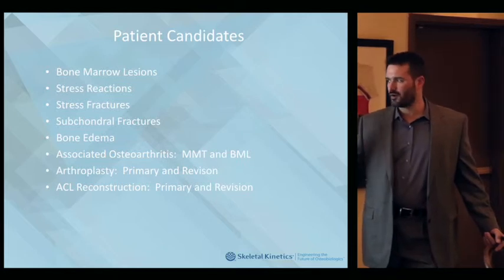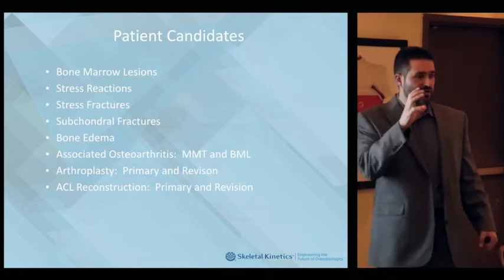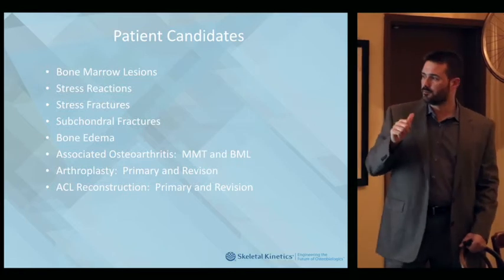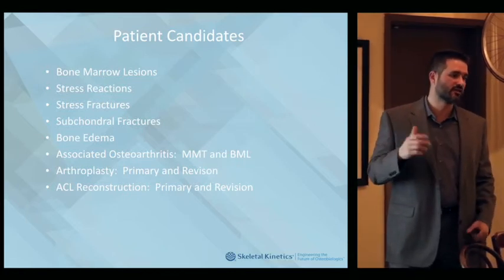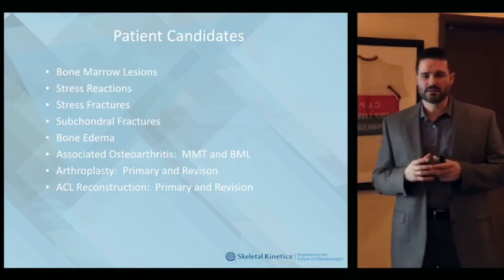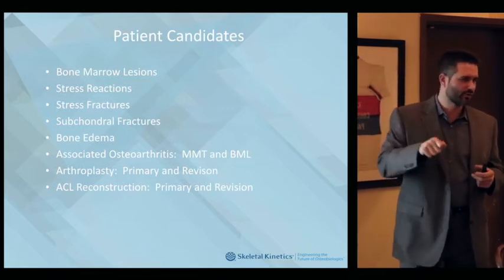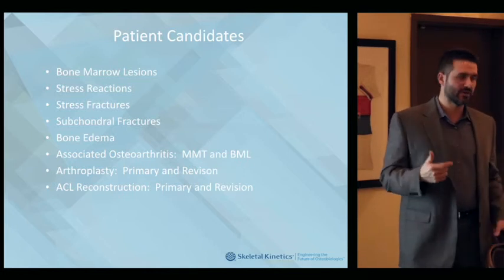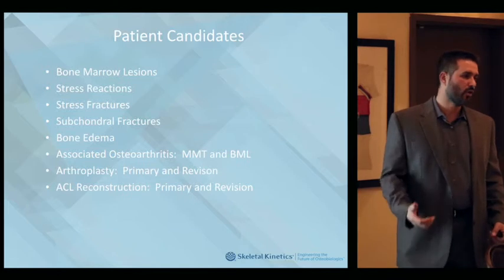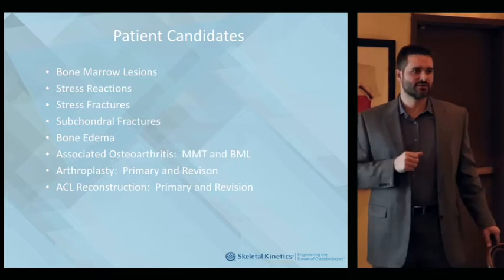I have an associate who was doing a shoulder replacement. It was a revision. Went in, the patient had a big glenoid void, and he needed to fill an area of it. He put that in, let it harden. Came back 3 months later, and couldn't even tell where that void was. So I've thought about some of my glenoids in older patients that might have a big glenoid, but in the center it's void. When I drill or put a screw in, I'm not getting good purchase. I haven't had to do it yet, but next time I'm going to inject that area, wait 10, 15 minutes, and then drill through or put the screw in and let it harden around, because I think it gives that structural support, or the strength, I should say.